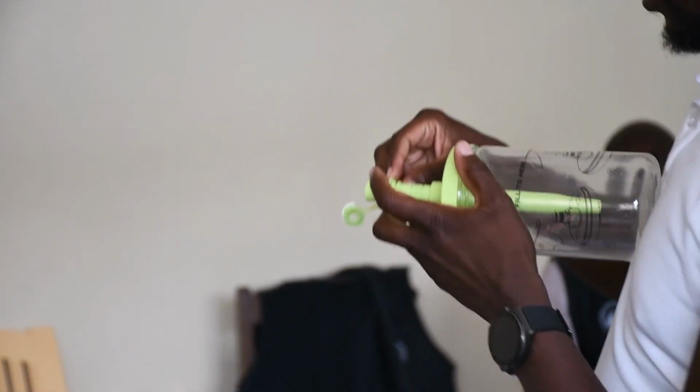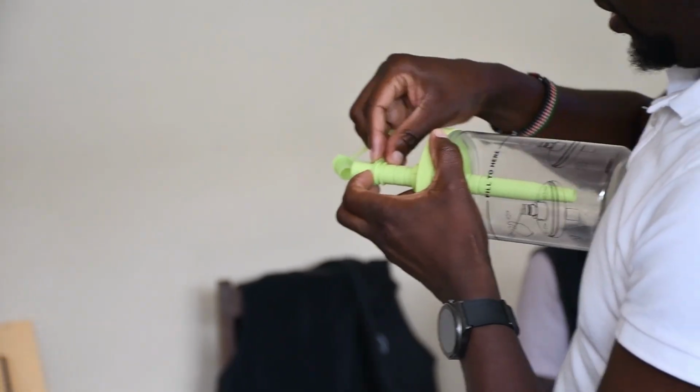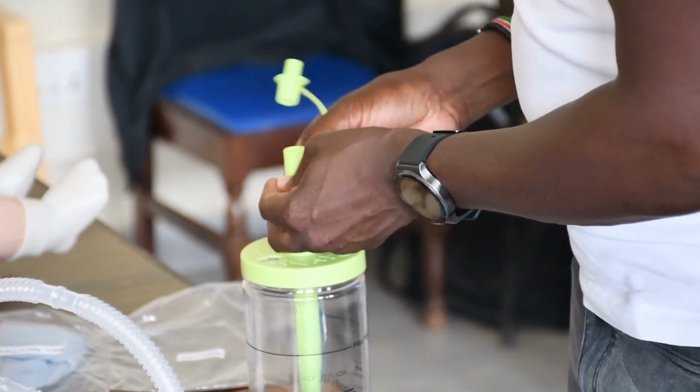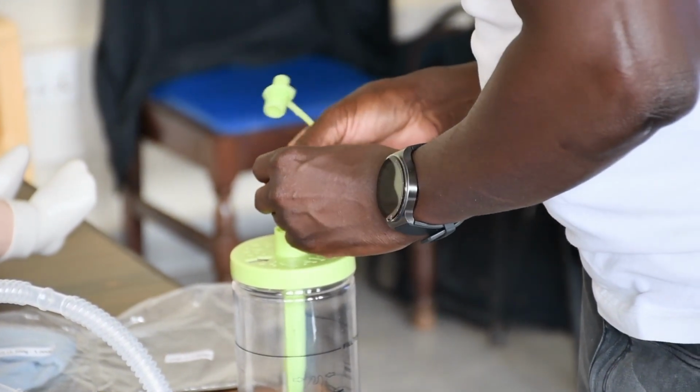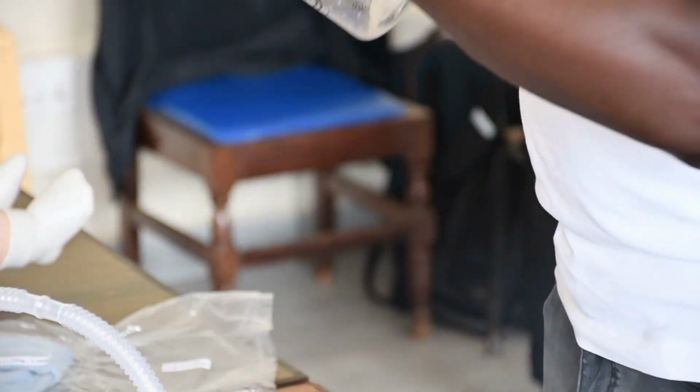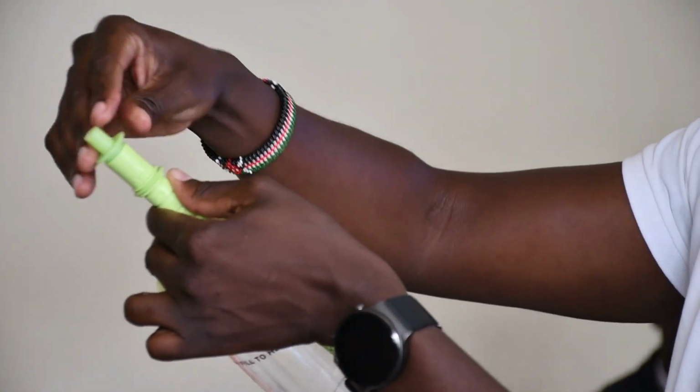It comes in and rests within this depression here. This is just to help hold it here so that it's not moving everywhere. Then that comes there, make sure it's tight, and then you are able to connect that.